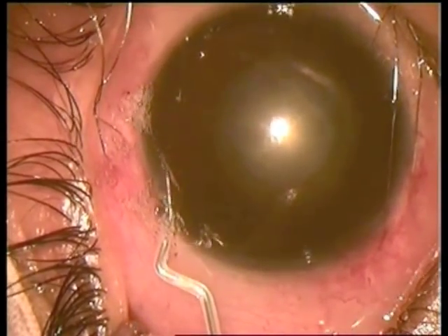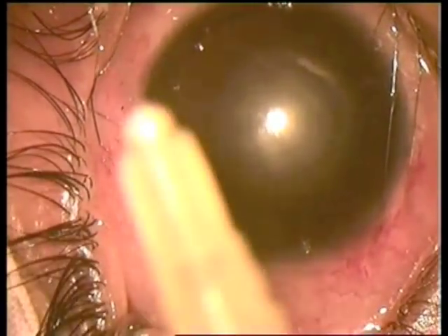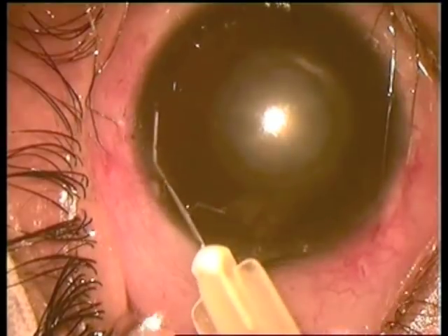The fluid is coming out. A thin cannula is taken in to verify the iridotomies.